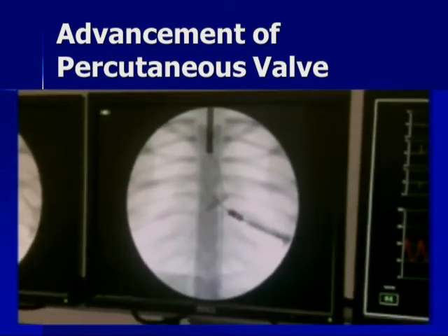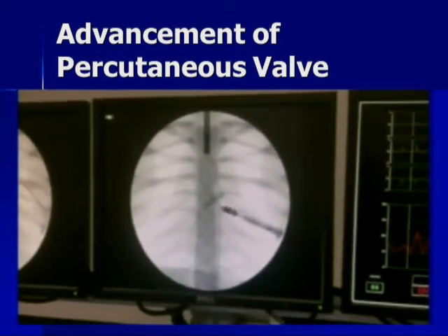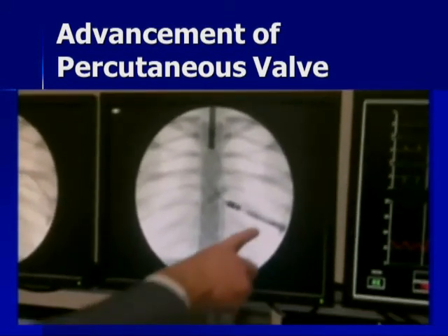But this is Joe just showing an example of, he's actually directly inserting this catheter into the mannequin through the exact port, using the exact tools that we're using in the clinical setting. So it's identical tools. Every manipulation you do on these catheters, the buzz, the dials, everything is simulated in this environment. You want to hop forward one more?